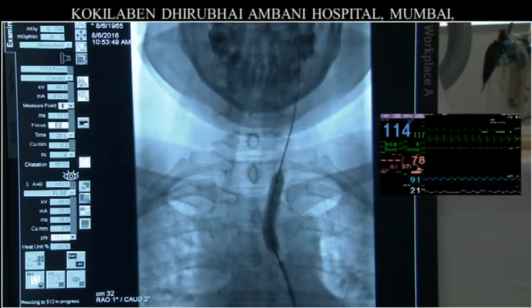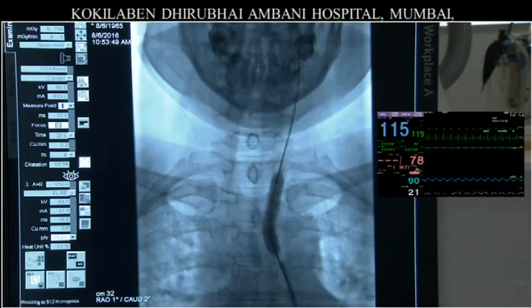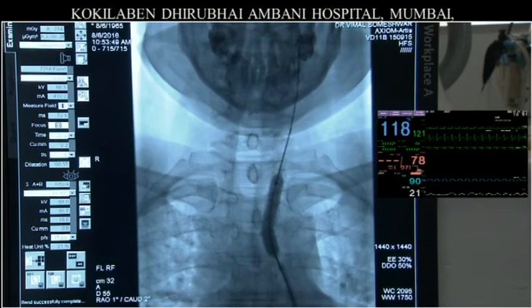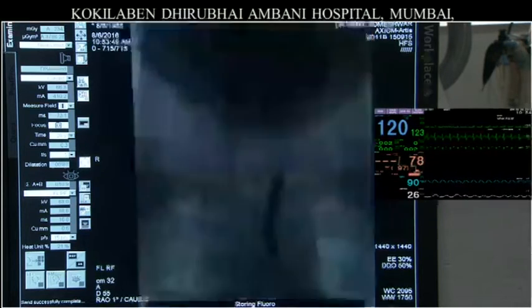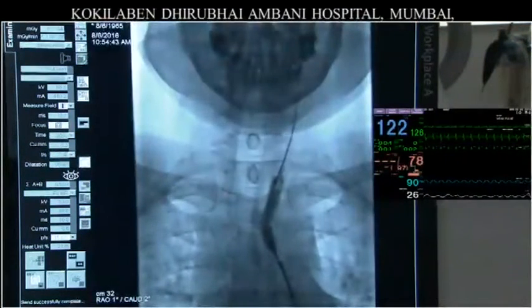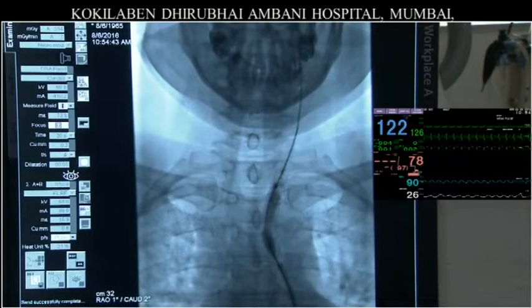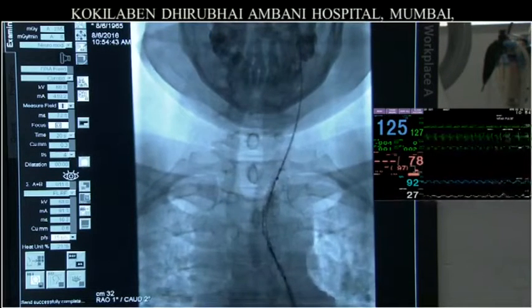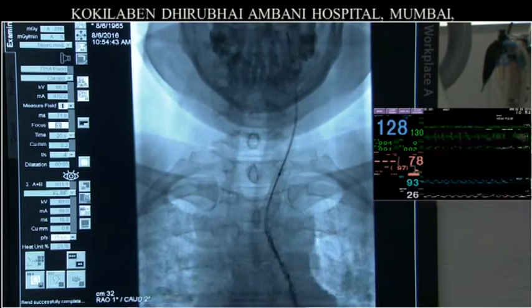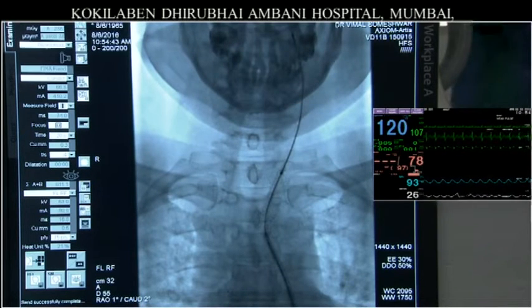a TAVI delivery system with this TAVI right atrium down the left ventricle VA loop with a stiff wire, and the TAVI is railroaded down to the mitral position, and under rapid pacing it is deployed. And this was the very first transvenous mitral valve implantation back in 2011.